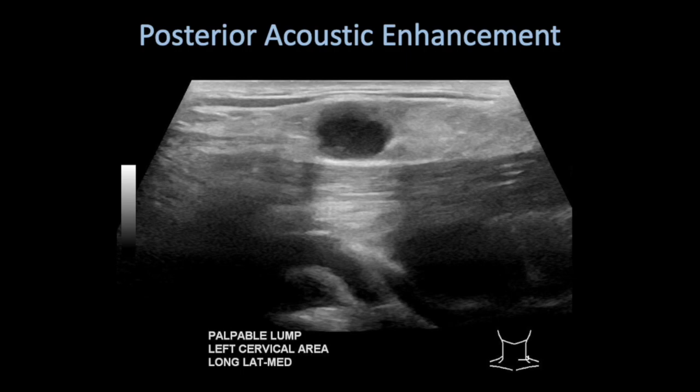It's important to keep in mind that posterior acoustic enhancement does not always mean that something is a cyst. Here's an example of an abnormal lymph node in a patient who ended up having lymphoma, where the lymph node is surrounded by fat density. The fat attenuates the sound beam much more than the soft tissue does, and therefore you get posterior acoustic enhancement.